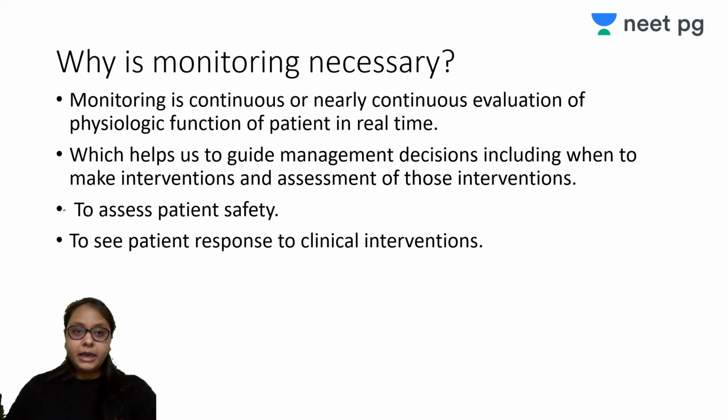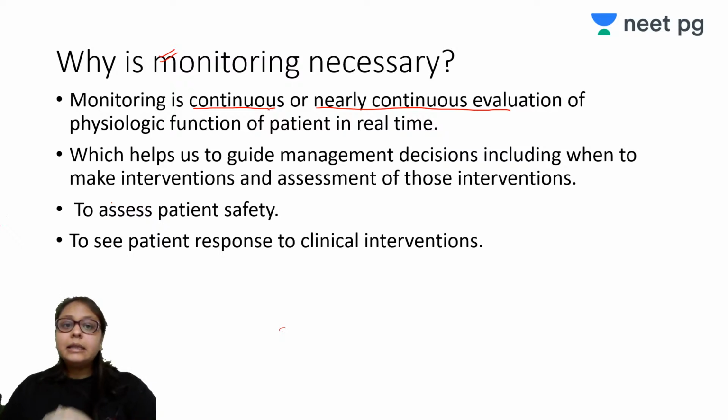So why is monitoring necessary? What is it? It is a continuous or nearly continuous evaluation of the physiologic function of the patient in real time, when he or she is under anesthesia. And this will help us to guide management decisions, including when to make interventions, and when the interventions are made, to assess those interventions. That will help us to assess the patient's safety and also to see the patient's response to clinical interventions.